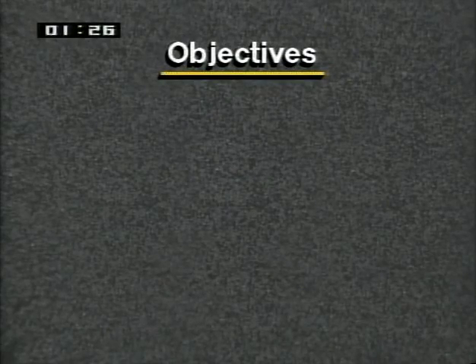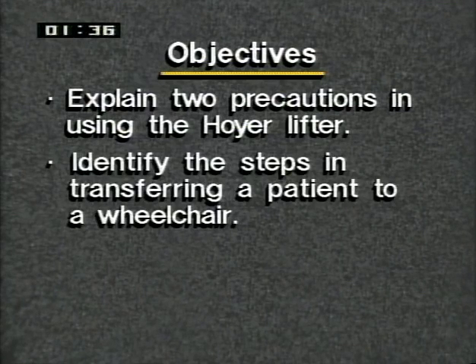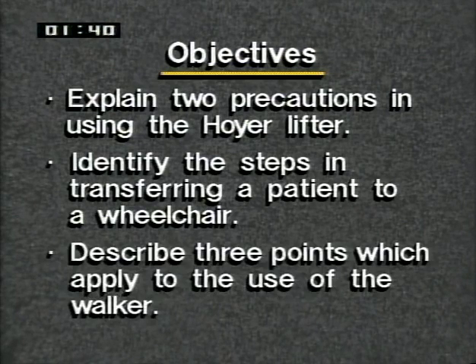This program is about equipment and moving your patient. After completing this lesson, you will be able to explain 2 precautions in using the Hoyer lifter, identify the steps in transferring a patient to a wheelchair, and describe 3 points which apply to the use of the walker.